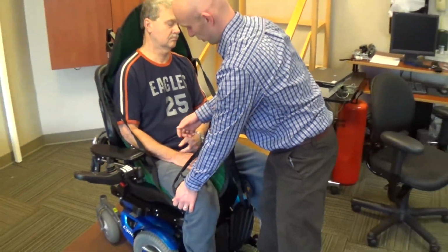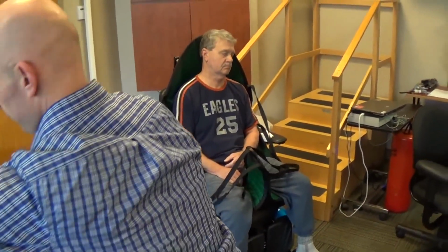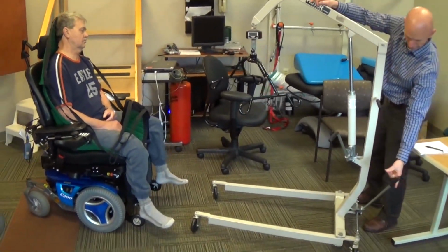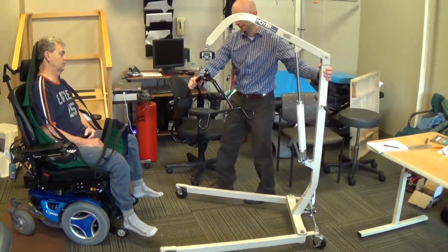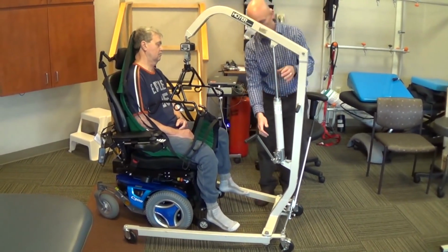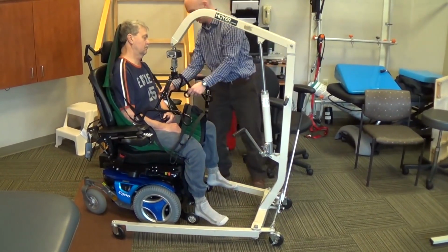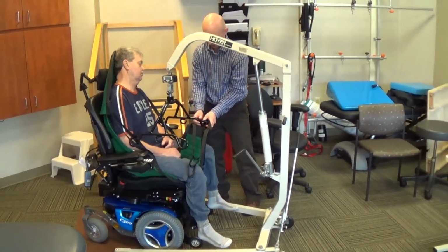And you just want to make sure the person's arms are inside the lift. And bring our lifter over. Next, I'm going to use the lever to open up the base of the legs to get around the chair. And you might be required to lower the lift arm just a little bit. Going to tuck both sets of loops through.